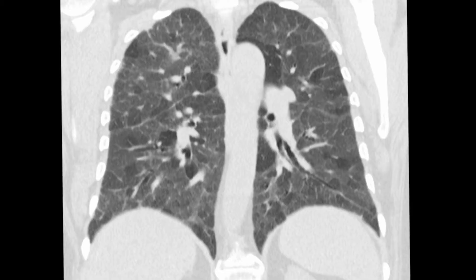In this coronal reconstruction you can clearly see well-demarcated areas of low attenuation due to air trapping against a surrounding ground glass infiltrate throughout the remaining secondary pulmonary lobules.